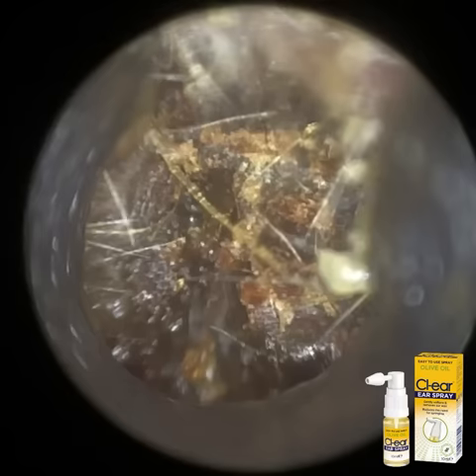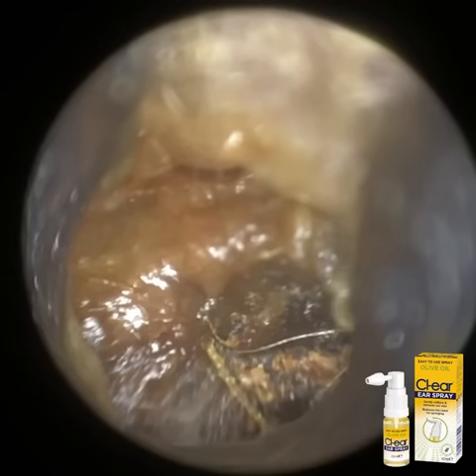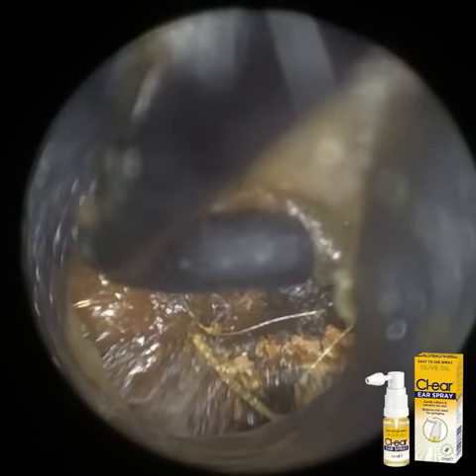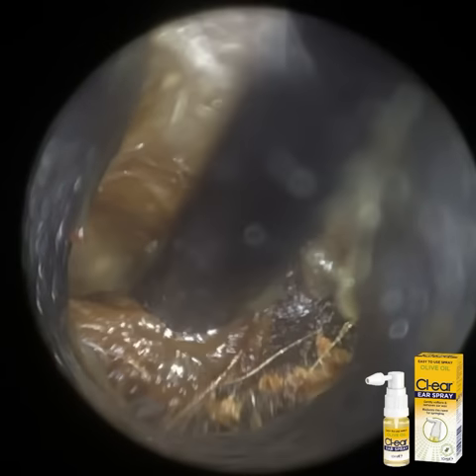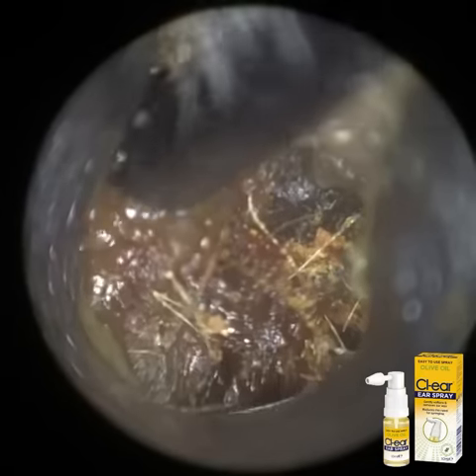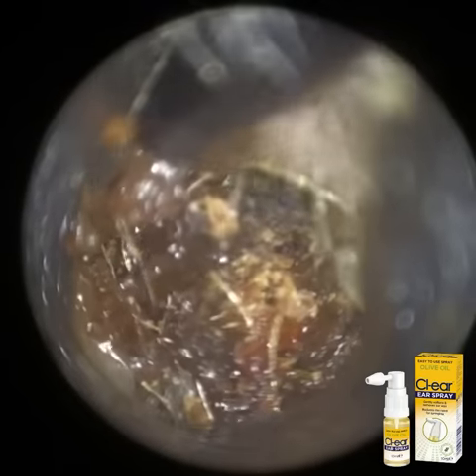So once again, I'm just going to dilate the ear canal open, and I'm just orientating it to face the roof of the ear canal. And I'm now using a St Bart's ear hook, gliding it through the speculum, through the roof of the ear canal. And then once I've entered the ear canal, I've rotated the hook clockwise by 90 degrees, trying to get into the core of the wax and bring it forwards.